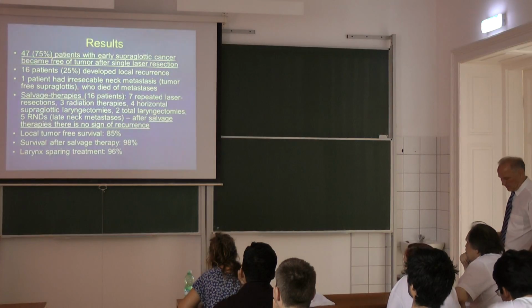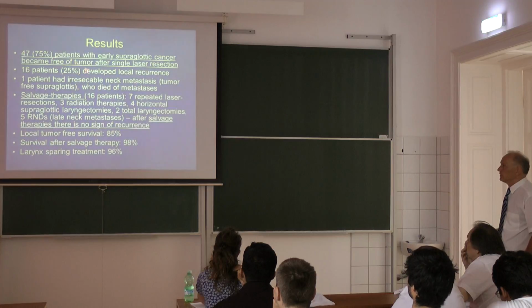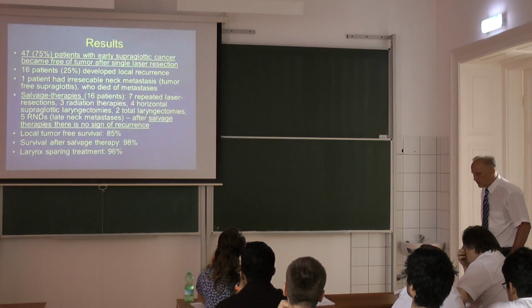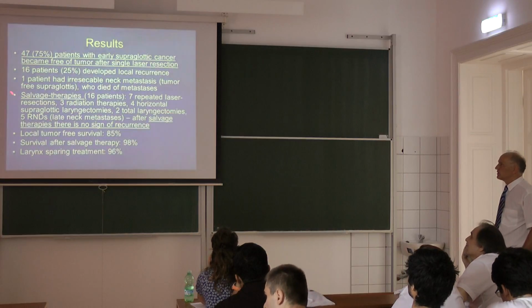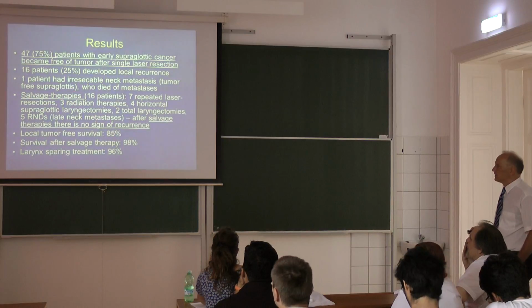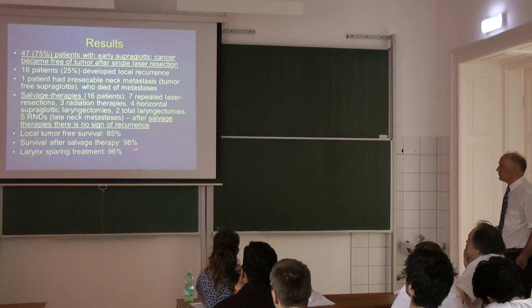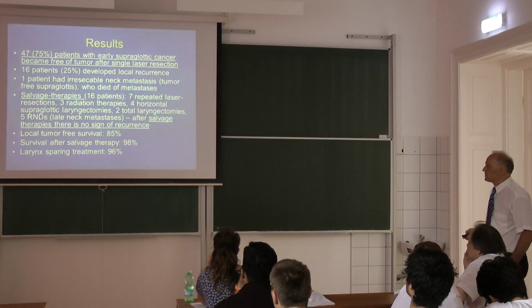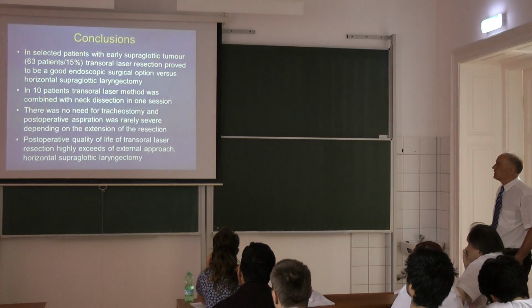So as an end result, I'm going to tell you that 75% of our patients heal after primary laser treatment. The other treatments are as follows here: repeated laser and external approach surgery as well. But we achieved local tumor-free survival in 85%. You see here the Kaplan-Meier curves on local tumor-free survival.